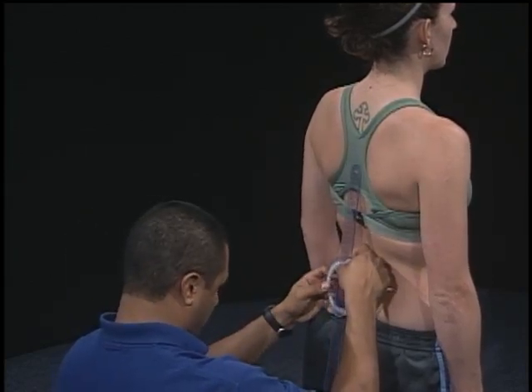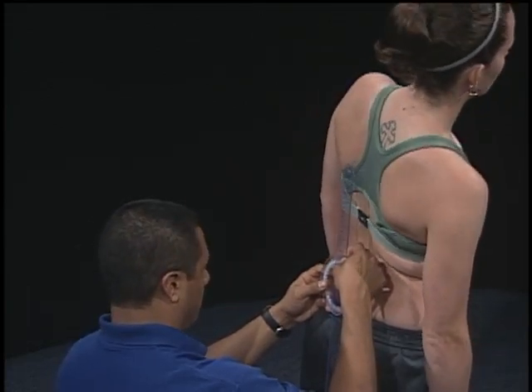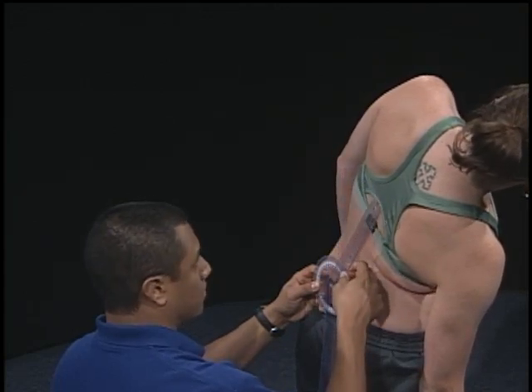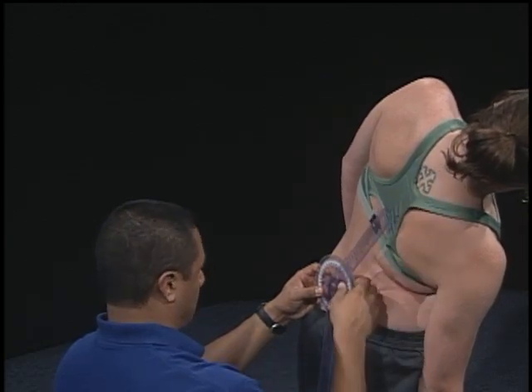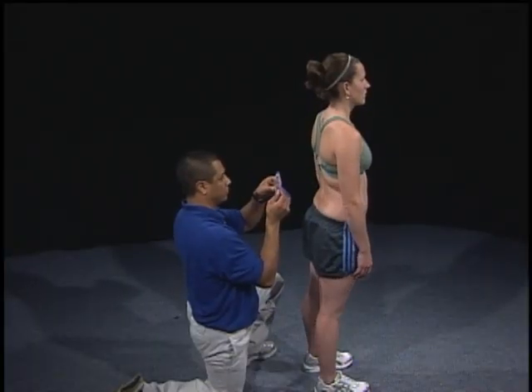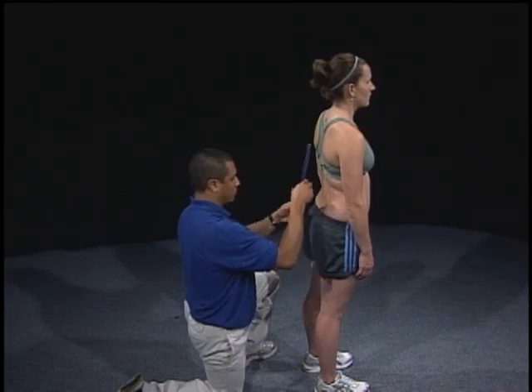Ask the patient to perform lateral trunk flexion as done previously, maintaining the goniometer in alignment through the entire range of motion, and observe for any extraneous movement of the pelvis. Read the degrees of motion on the goniometer and then ask the patient to return the trunk to the starting position. Remain at eye level of the goniometer when reading the measurement.